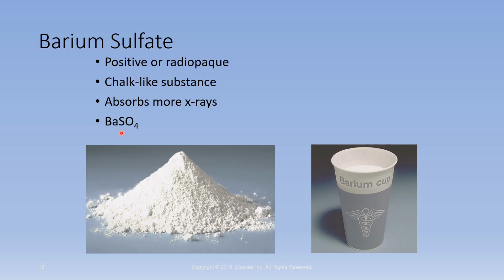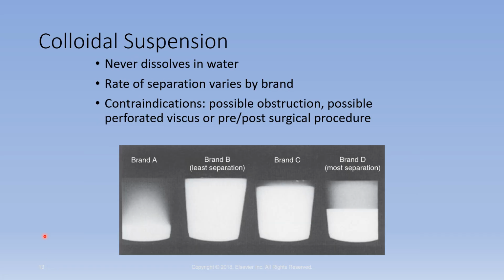Okay? And there are pictures of some of the different contrast media on page 473. They show you some of the different brands of barium sulfate along with the gas-producing granules and tablets. This cup of barium can be thin or thick.